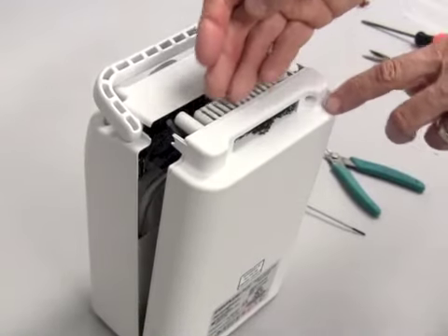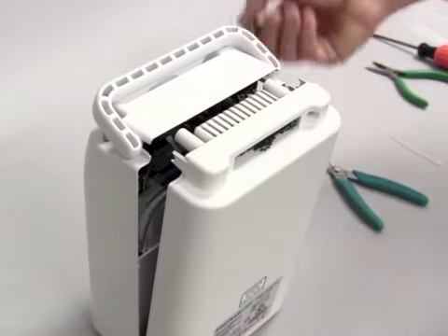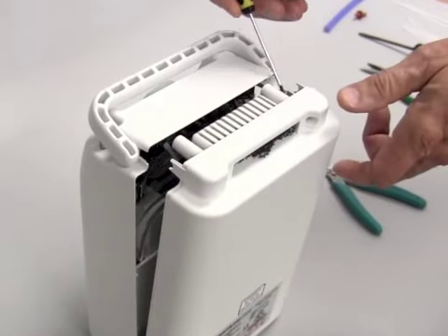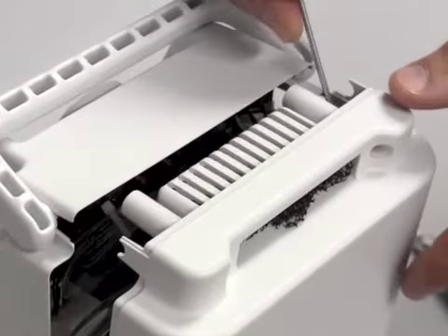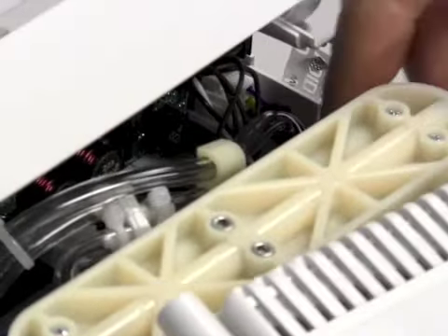With the screws removed from the back cover and the label taken off, the next step is to remove the sieve beds, which are contained in the back cover, so that you have access to the sieve beds. You take a flat blade screwdriver, hold the sieve beds and pull the cover away from the sieve bed assembly.